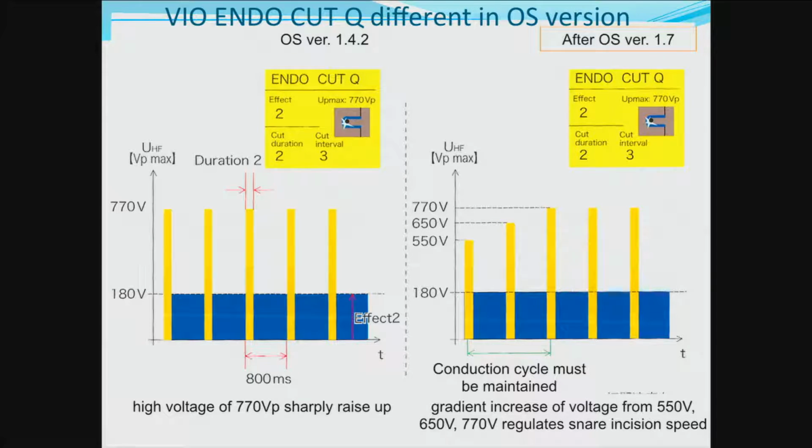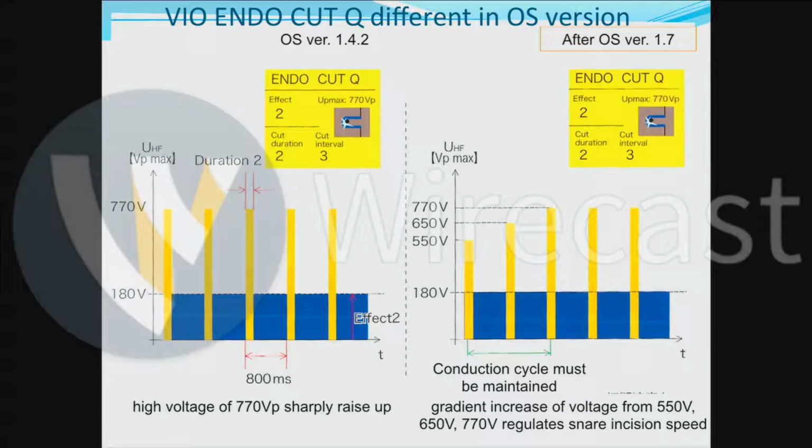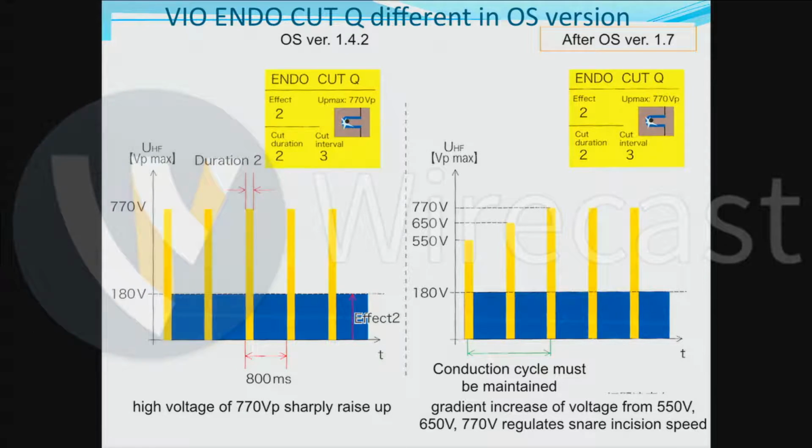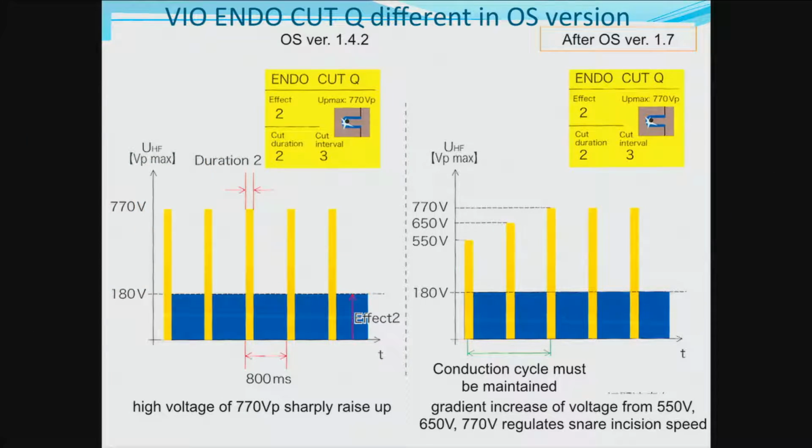This is without an assisting system similar to power peak system. Electric arc control requires high electric current under low voltage. So end cut IQ instantaneously changes electric discharge to arc discharge by quick high voltage and maximum electric conduction. This is the impulse properties.